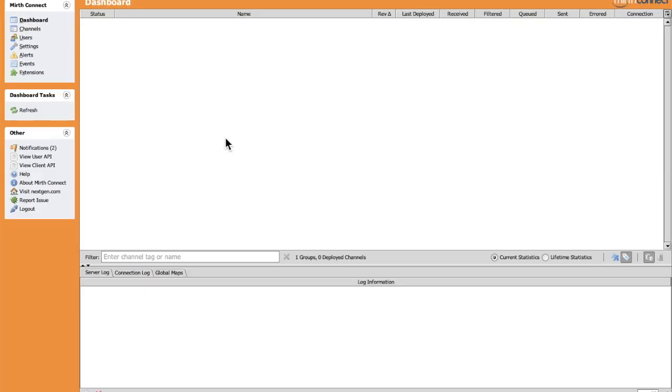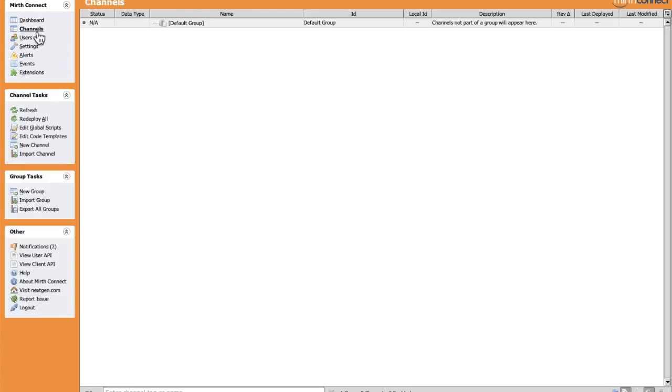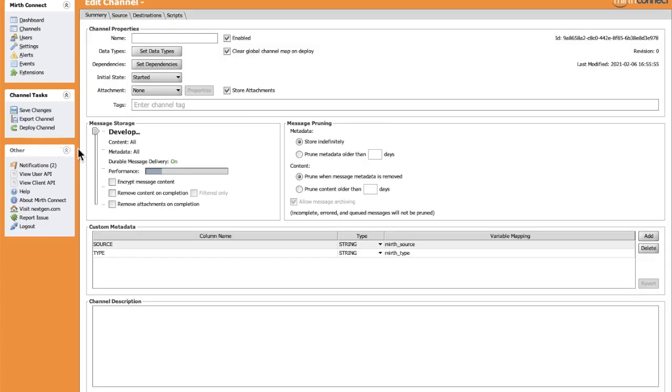Hi guys, we will see how to parse and validate HL7 messages. To do so, we will create our first channel in Mirth Connect. We will configure it and see how we're going to achieve the parsing and validation using this channel. Let's create our first channel. We'll go to Channels, New Channel, and give it a name, for example HL7 Parser.